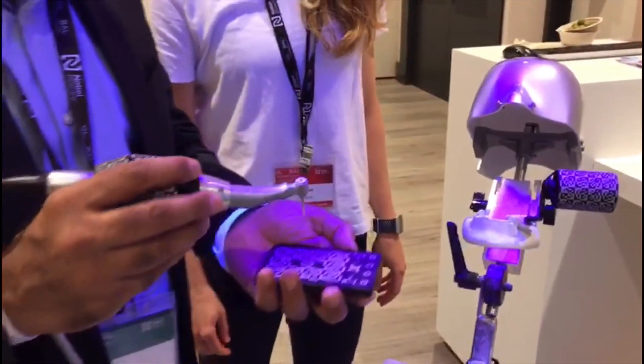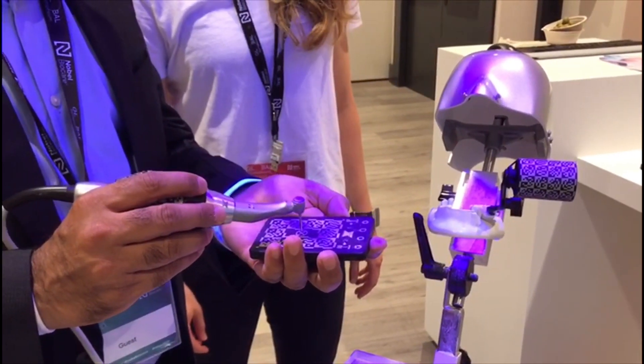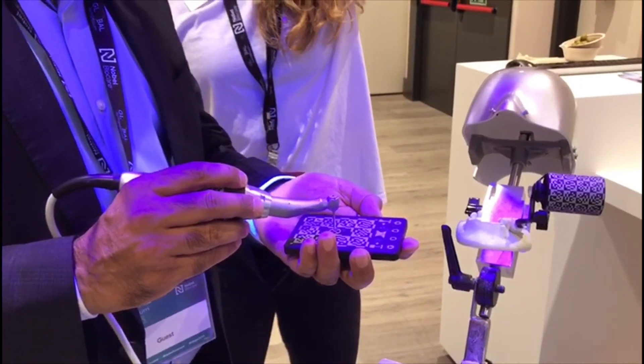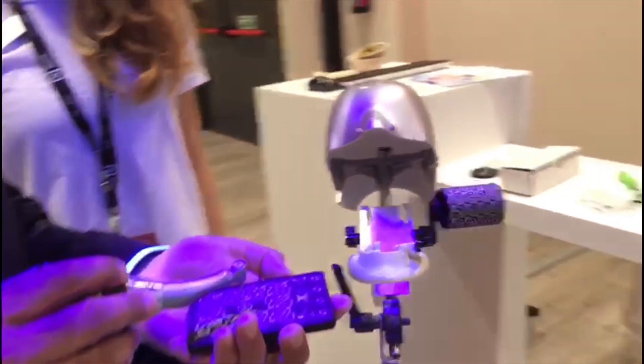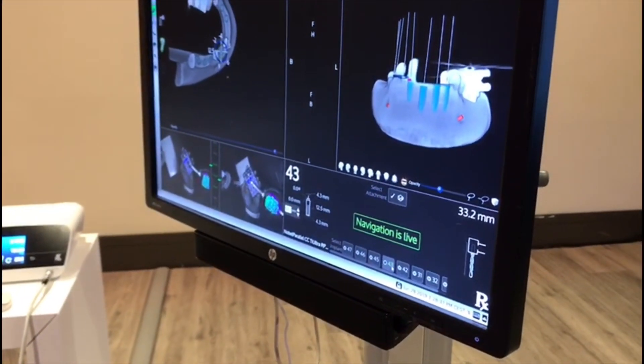This is your handpiece. And what do you call this? A go plate. You place the handpiece on the go plate underneath the cameras, so you get the depth of the drill. Now you have the length — it shows you the length — and you're ready to go.